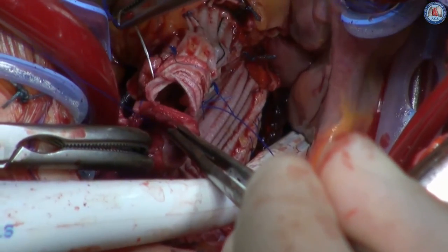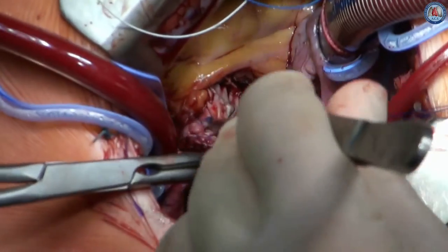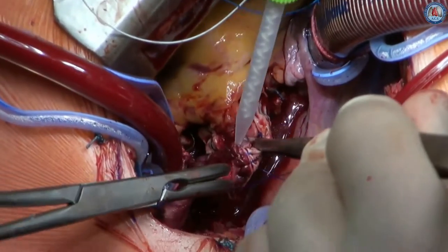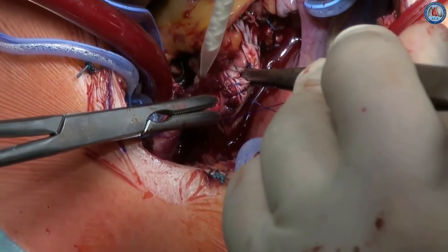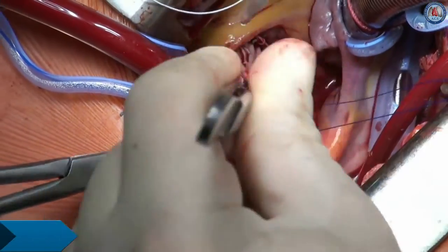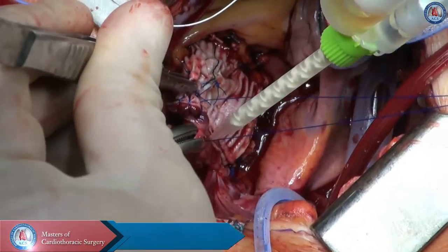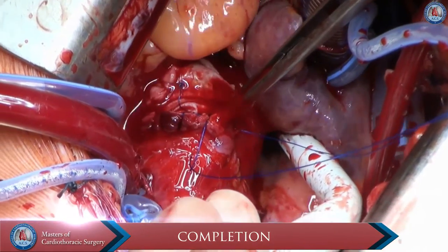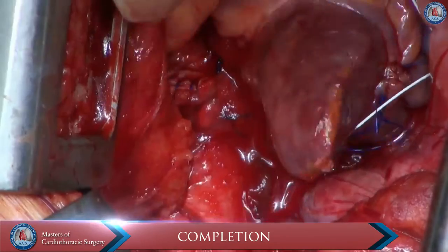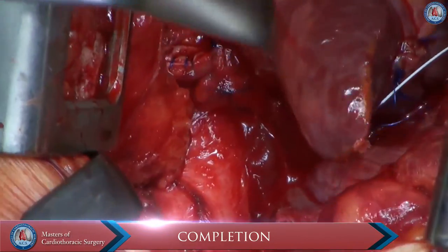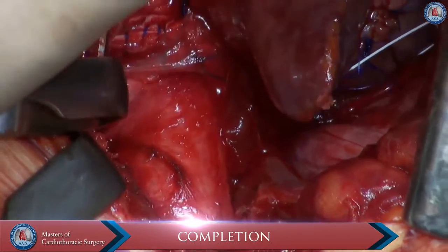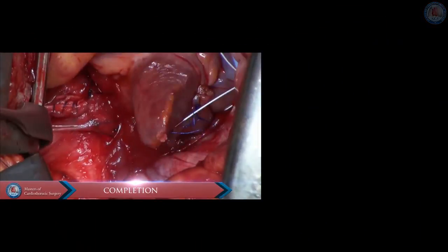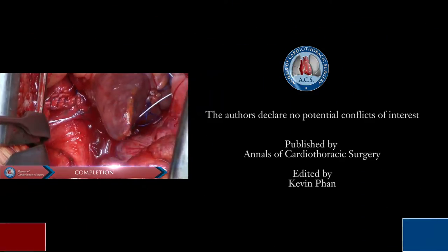The surgical result is assessed by intraoperative transesophageal echocardiography. After weaning the patient from cardiopulmonary bypass, meticulous hemostasis is performed before closing the chest.